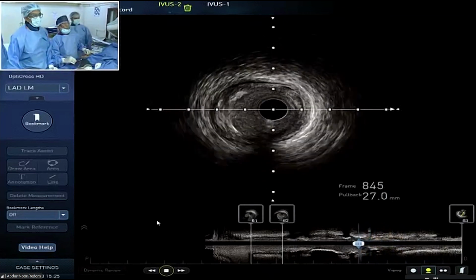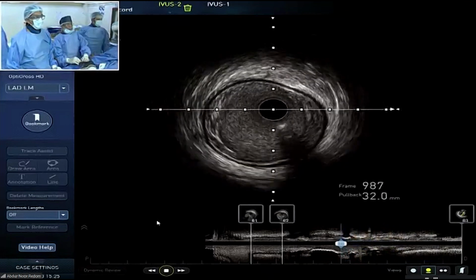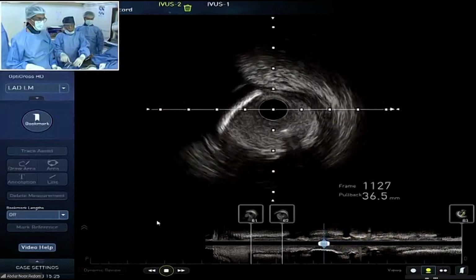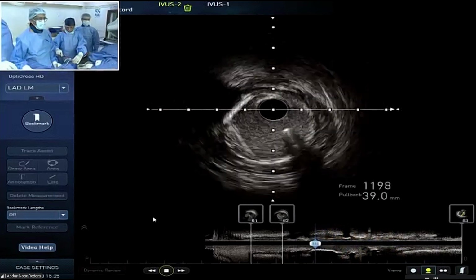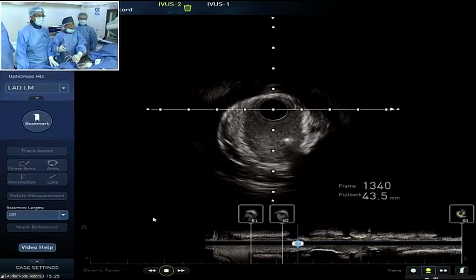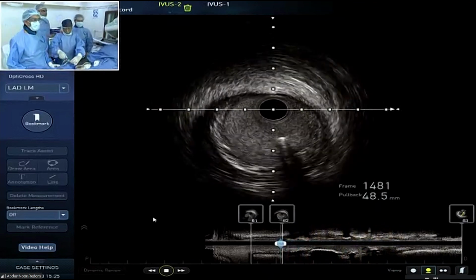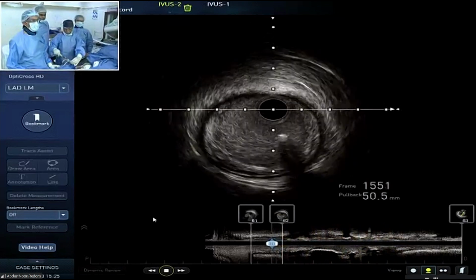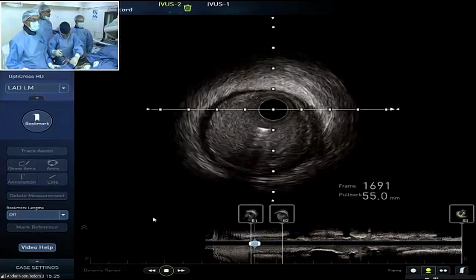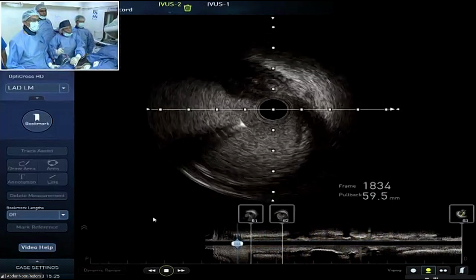So for balloon uncrossable lesions, what attempts have been made, for example with the 1.5 balloon? If there is angiographic calcification, then you can immediately attempt to do a rotor straight away. But on this angio, as you can see, there's not much calcium visible. There's no tram track appearance of calcium on either side of the vessel. So we decided to see whether we are supporting the blood pressure, which is a little bit on the lower side right now. But we thought we could cross with the 1.5.